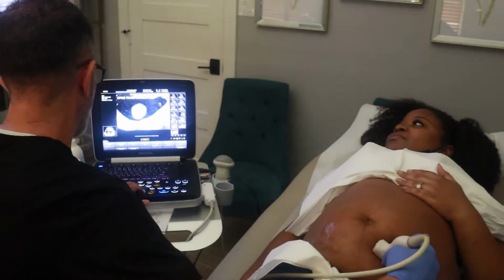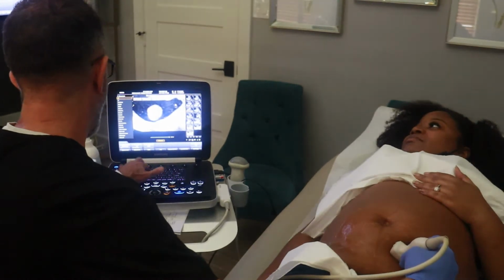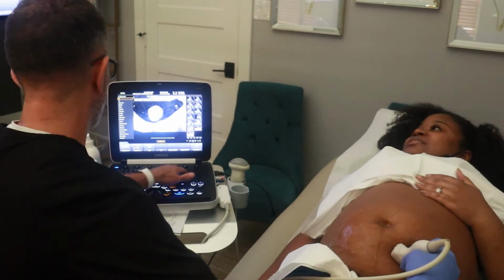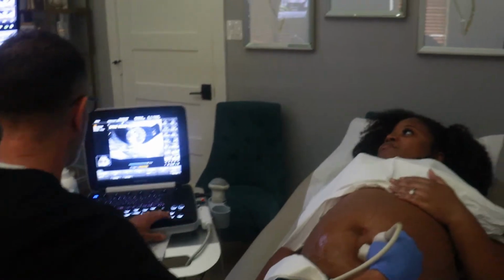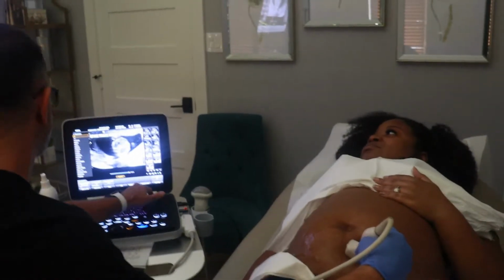Okay. I'll do some cross-sectional views, mid-abdomen, a little of the kidneys. How do the kidneys look? From what I can see, just fine. Can't see them that great, but we can tell there's no fluid buildup in that area, which is good. That's the main thing we look for.